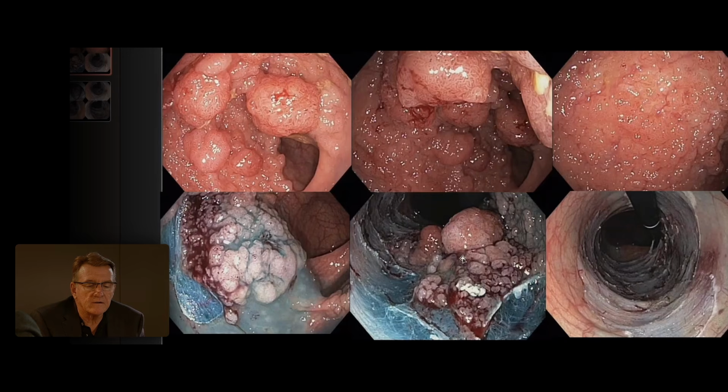I want to point out, we haven't touched on resection yet, but I want to point out something very interesting that I just noticed here. Now, when you excise a lesion, at the margin you always have a crisp diathermy image, a crisp diathermy white line where the submucosa is interfacing with the epithelium.